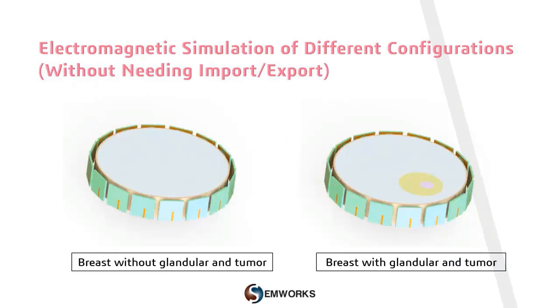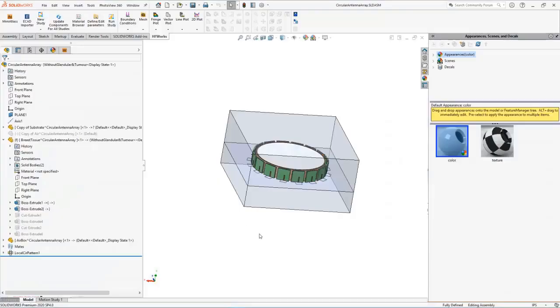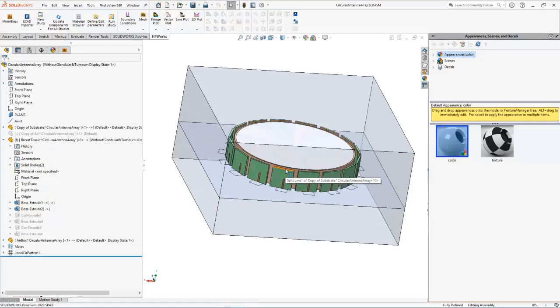Inside SOLIDWORKS, I'm going to show you how to build this model and work with multiple configurations and do simulations. So we will have a case where we will consider an antenna with a normal breast and what happens if a tumor is inserted inside the breast glandular. So now I'm going to switch to the model inside SOLIDWORKS.